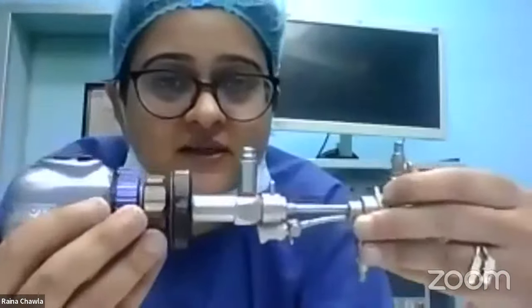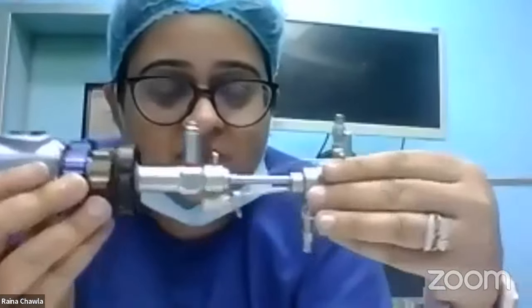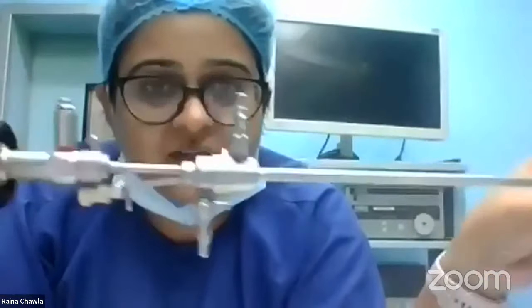Okay, so this is hysteroscopy. It's used to visualize the uterine cavity, and we can also do operative hysteroscopy using this instrument. We can remove endometrial polyps, we can remove adhesions like in Asherman syndrome, and we can cut uterine septum.